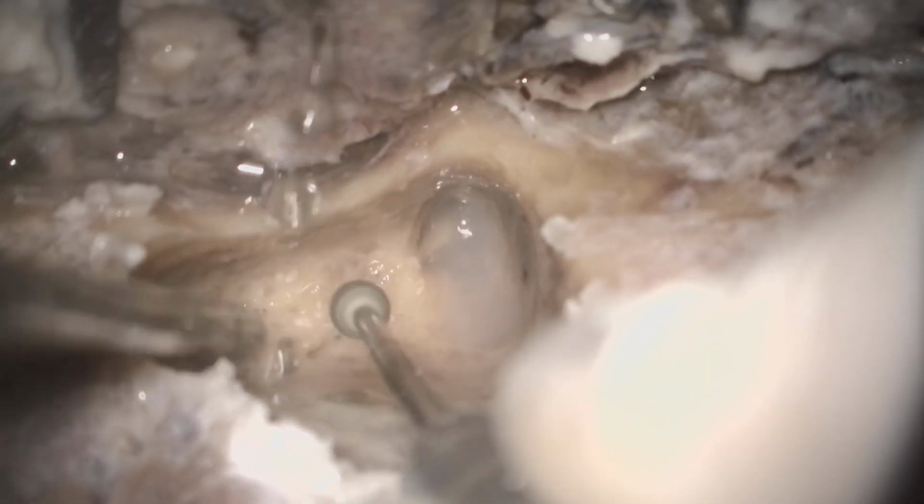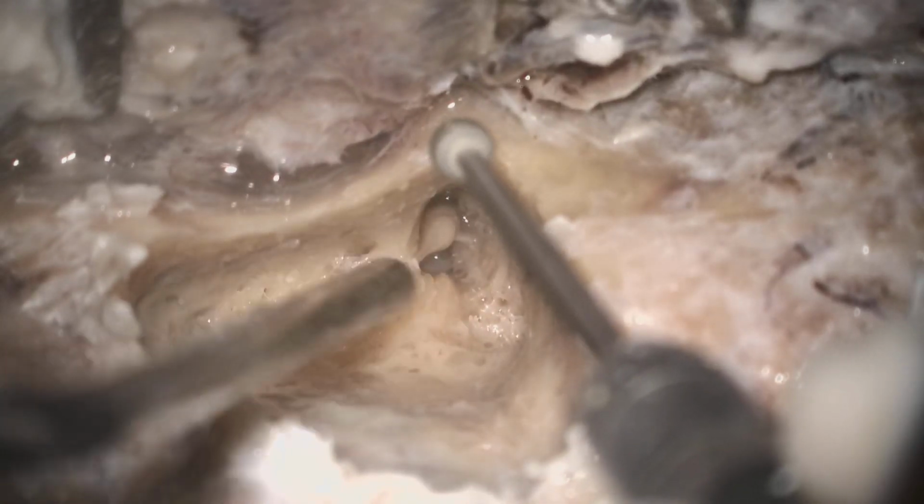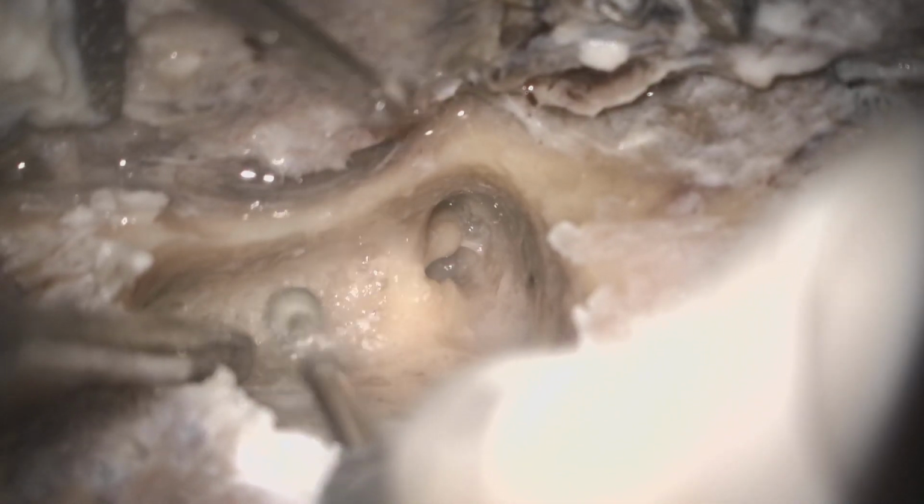So this is the part you have to drill thoroughly, and always remember the direction of drilling. The direction of the bur will be along the important structure, that is the facial nerve. So like this, in that way. So go drilling slowly, and you will eventually identify the facial recess area.